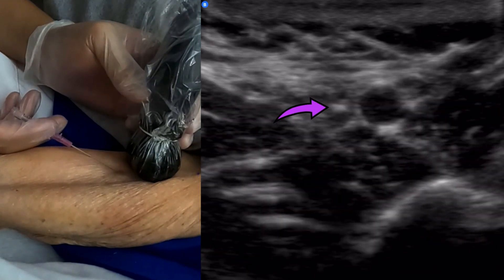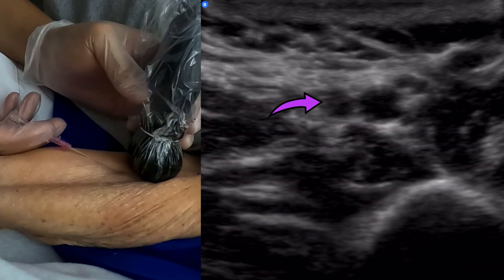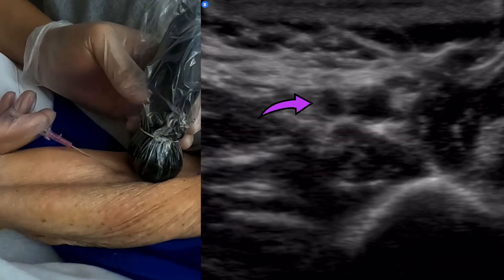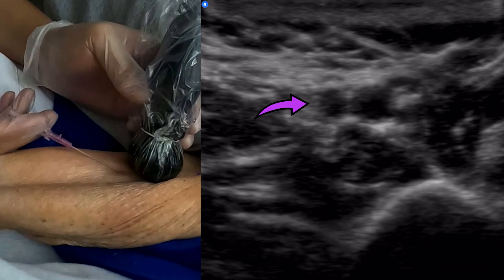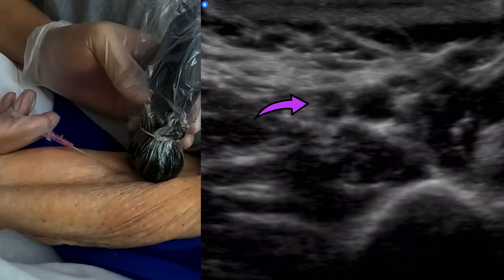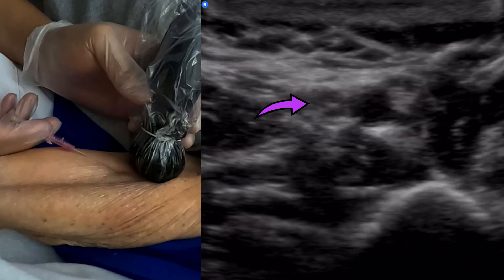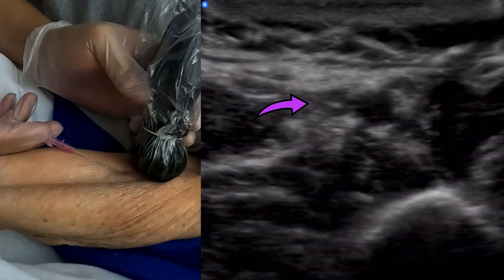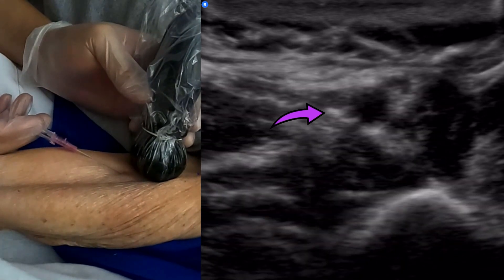You want multiple points of contact so that your probe hand doesn't slip when you don't want it to. Now there's my needle tip. I'm going to advance the probe, then the needle, then the probe — alternating: advance the needle, advance the probe, advance the needle, advance the probe.